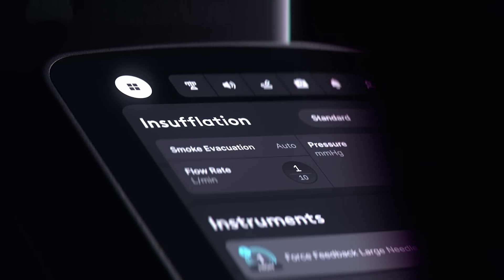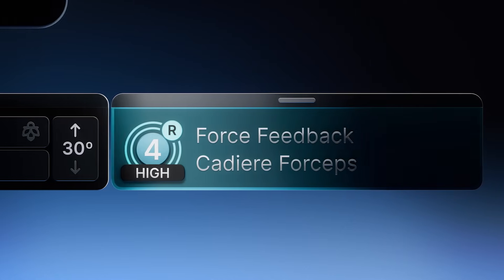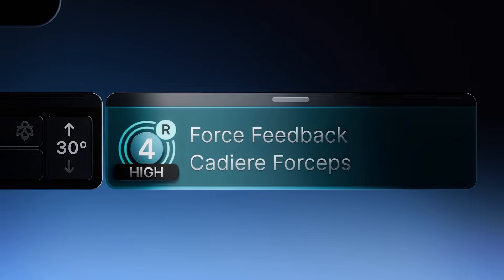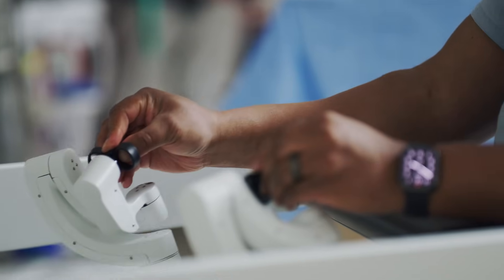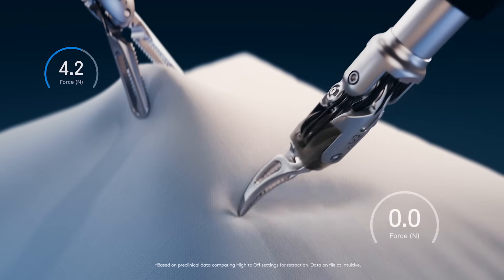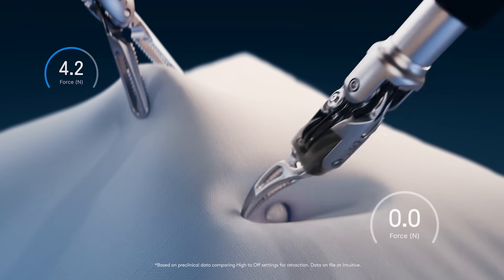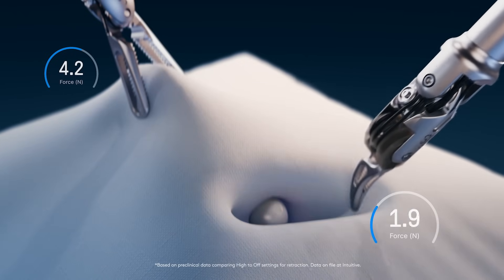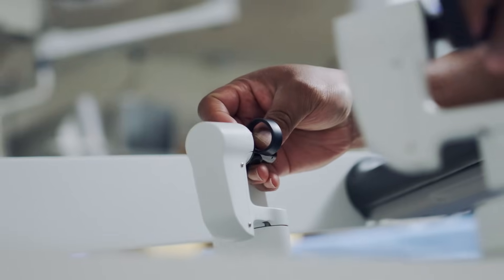I've never seen anything like this before. Force feedback is the first-of-its-kind technology. In pre-clinical trials we're seeing up to 43% less force on tissue. That translates to gentler surgery for patients.